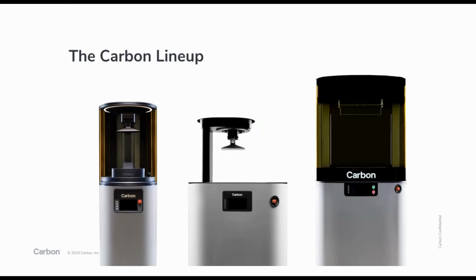As Steve mentioned, the Carbon platform includes hardware, software, and materials. So one of our first considerations is selecting our hardware. What I'm showing on this slide is the Carbon lineup, which includes the M series printers, the Smart Part Washer, and the L series printer. More details on Carbon's hardware offerings can be found on our website, but for the tibia cutting guide application, we will focus on the M2 printer and the Smart Part Washer. I'll share more details on the next two slides.